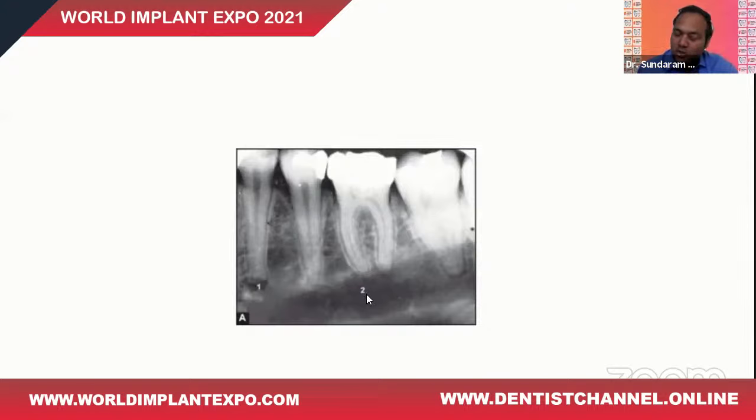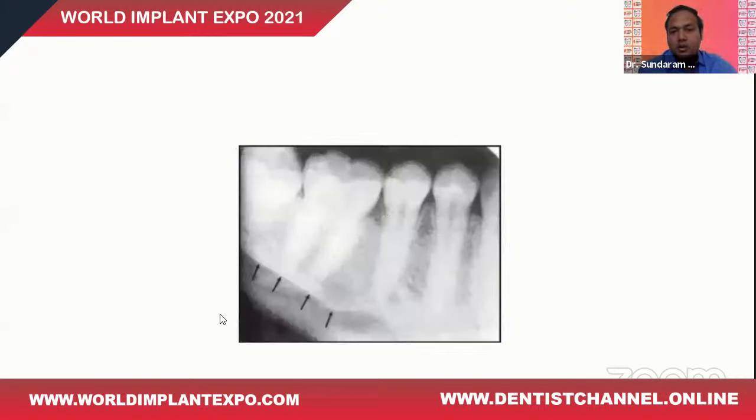And the number 2 is not a canal, but it is the submandibular fossa that gives you the generalized radiolucent appearance. So things can really be very tricky as far as the radiograph is concerned. Now, what could this radiographic feature be? This is the thick bone of the lower border of the mandible. The inside part of it will be showing the mylohyoid ridge. So that shows up as a very thick radiopaque line that you can see in this picture.